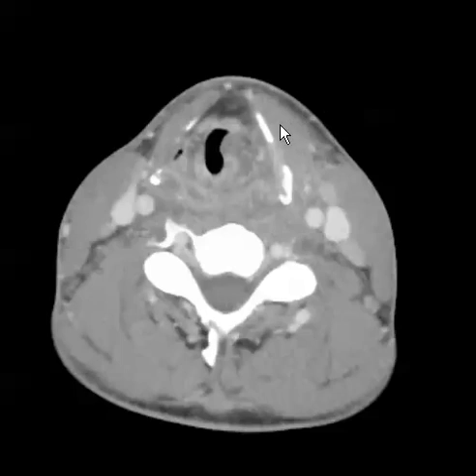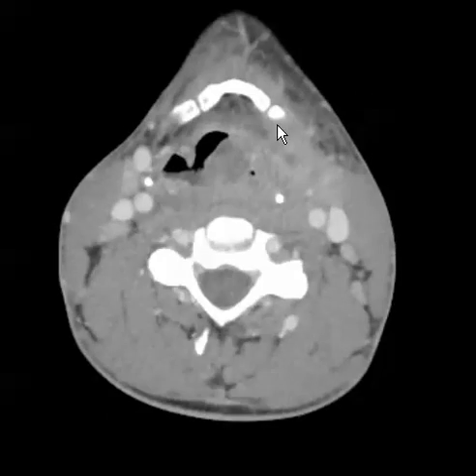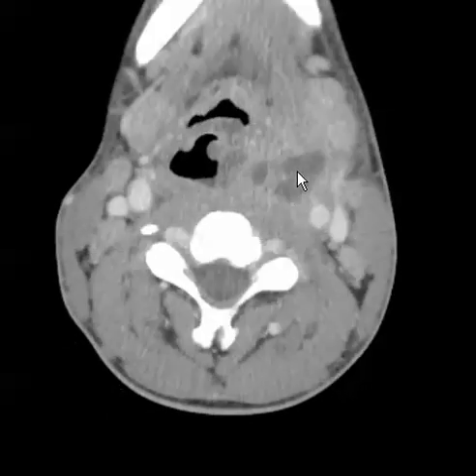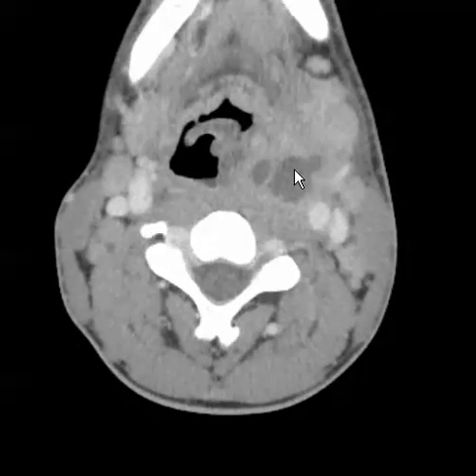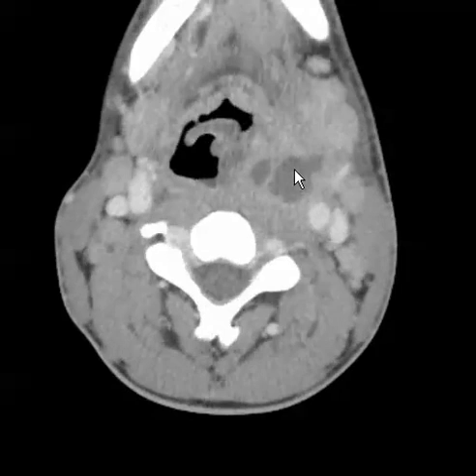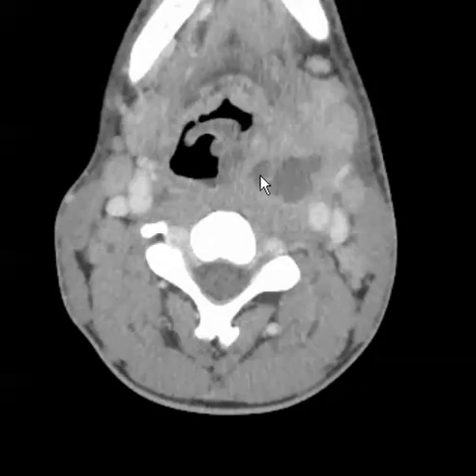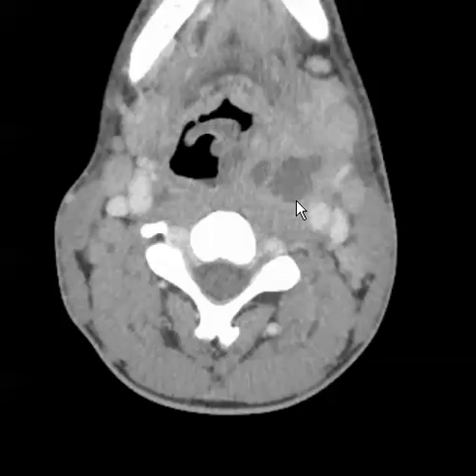As we scroll through the images within the neck, we already see a low-attenuating lesion with a peripheral rim of enhancement in the peritonsillar region on the left side. This is consistent with a peritonsillar abscess.